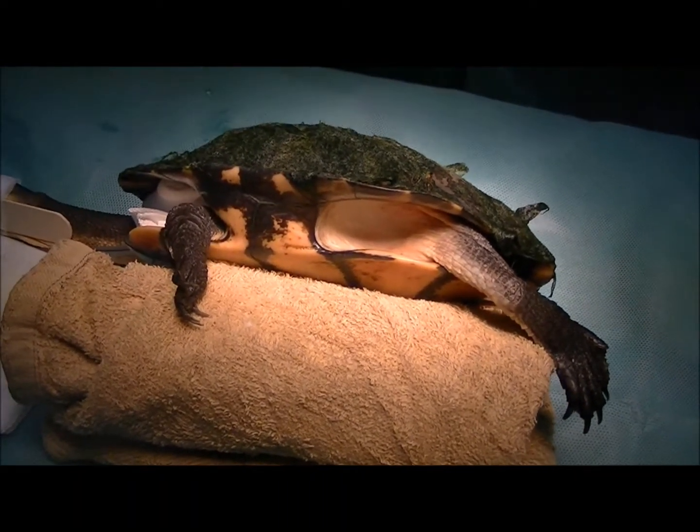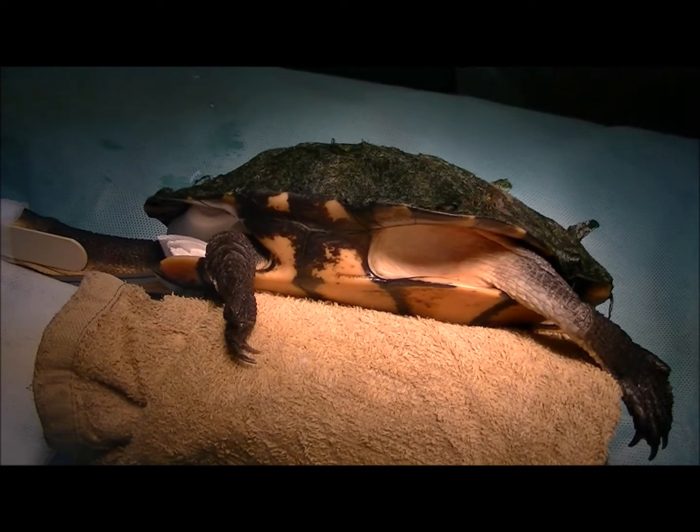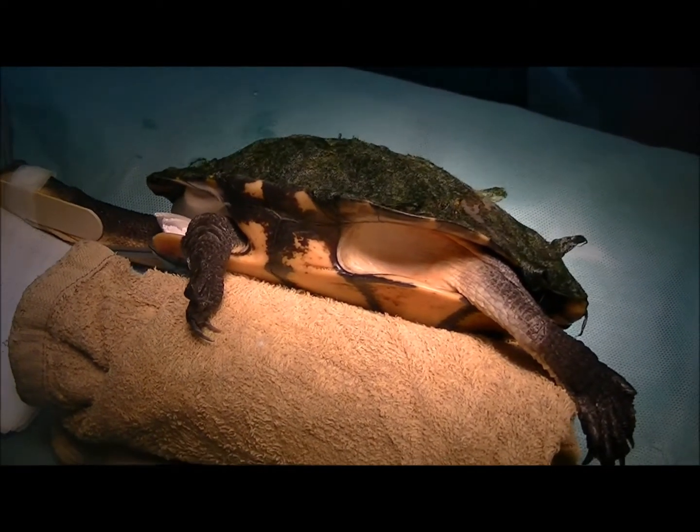So I've had a look down into the stomach of this turtle, and we could see the fish hook, but we weren't able to grab it and pull it back up, so we're going to take it to surgery now.